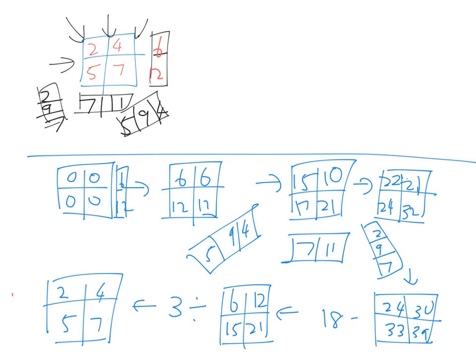Okay, so what are the benefits of CT scan? This is the cheapest and fastest way to get a 3D image. And everybody, except if you are pregnant or small children, can go through CT scan. But the bad news is, this gives you the highest radiation dosage. Understand? Alright, so these are the advantages and disadvantages.